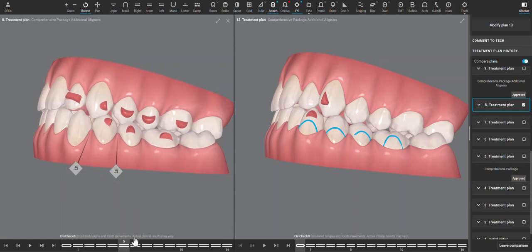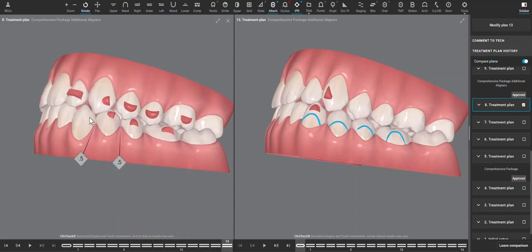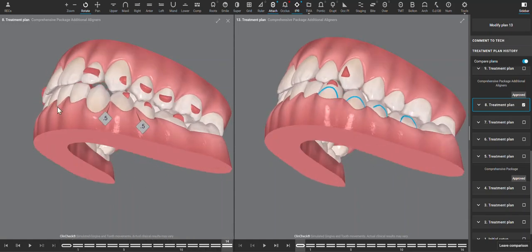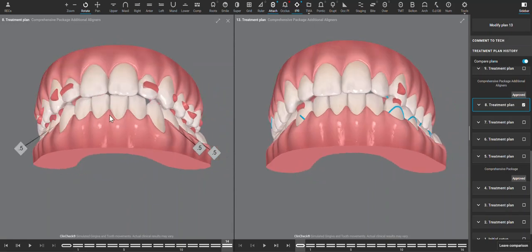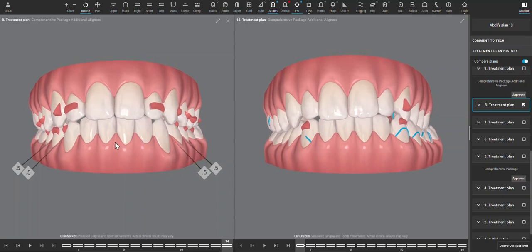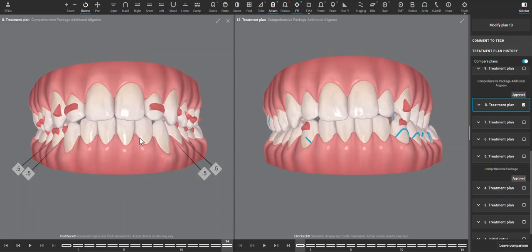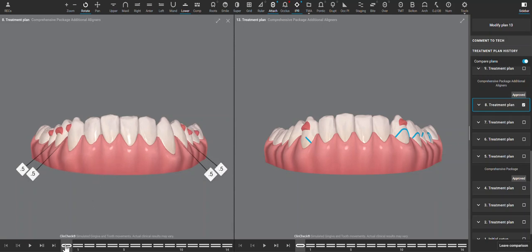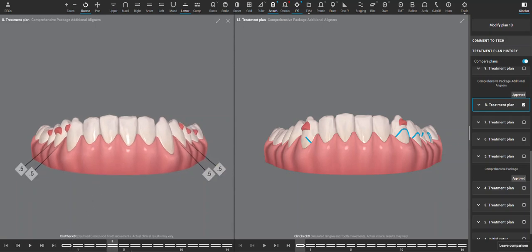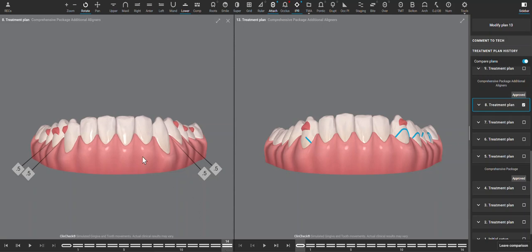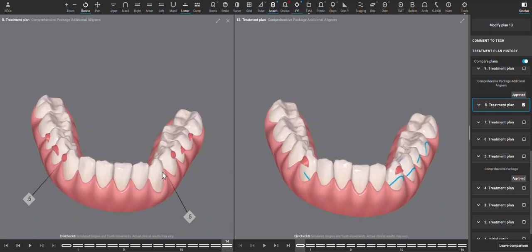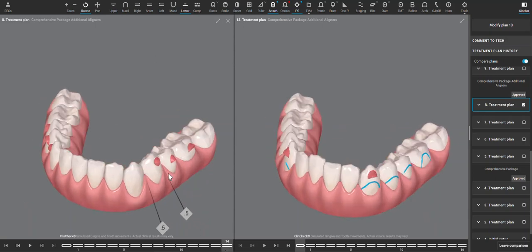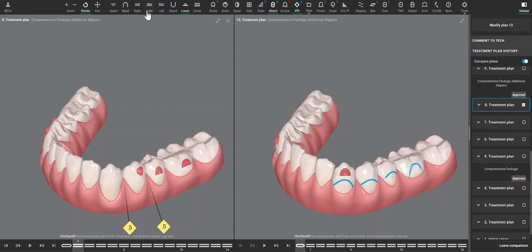Now, any of the intrusion I think needs to be over-corrected, because intrusion is a movement that the body tends to resist. So I would have on the ClinCheck here, if just critiquing it, planned for more intrusion rather than just retracting back.